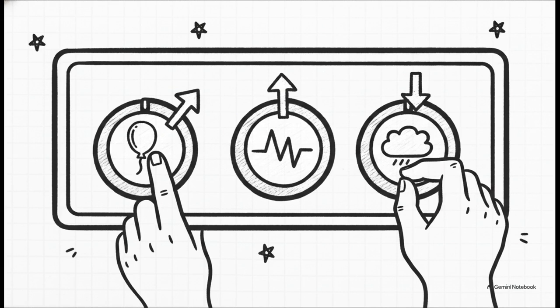That tidal volume of 400 is too low for an 80-kilo patient. It needs to be 480 to 560 to hit that 6 to 8 ml per kilo target. To maintain minute ventilation safely, you bump the respiratory rate to 20 or 22. And finally, that FiO2 of 60 is way too high for a PaO₂ of 127, so dial that down to 40% to prevent oxygen toxicity.